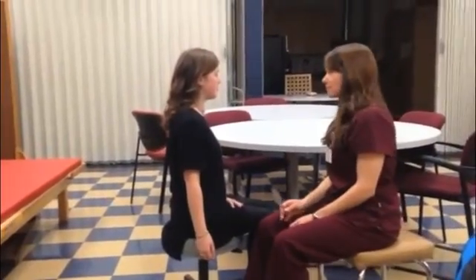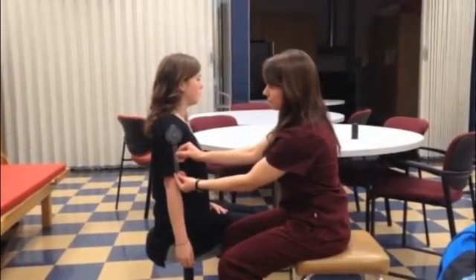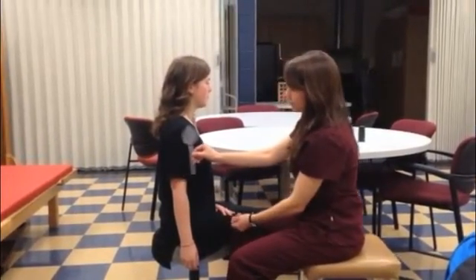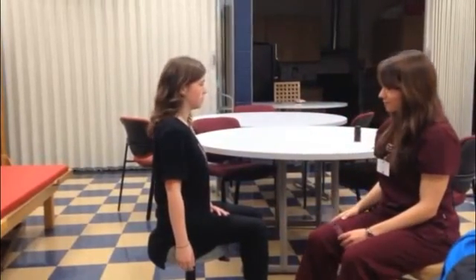When measuring shoulder extension, you line up the goniometer on the arm the same as you would for shoulder flexion. Have the patient in a seated upright position with their feet, knees, and hips all at 90 degrees.